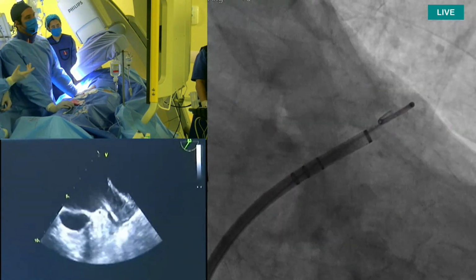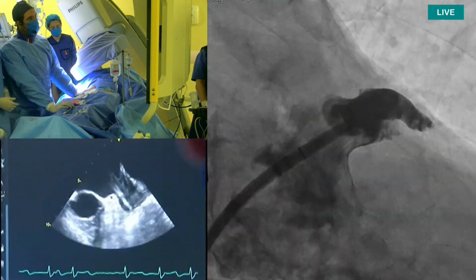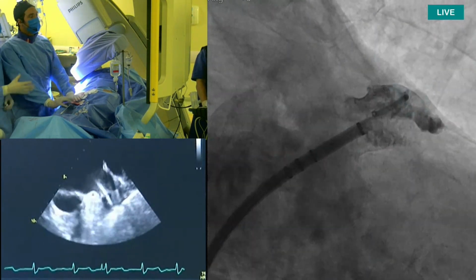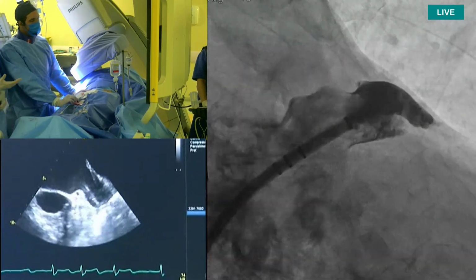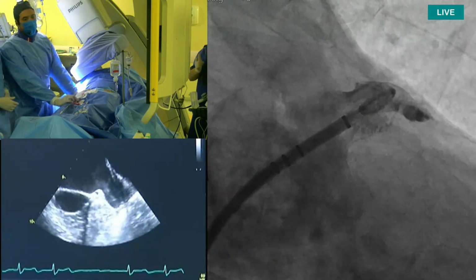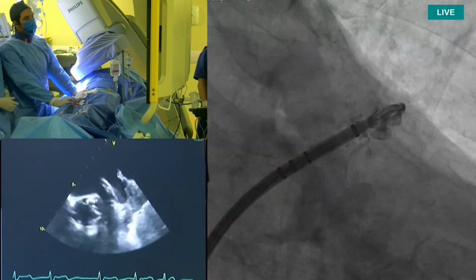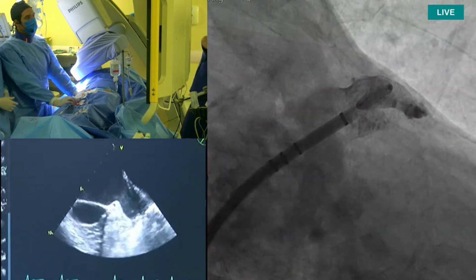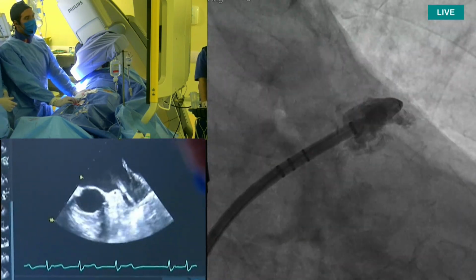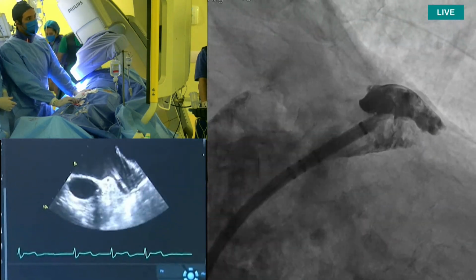Then maybe Fábio or Felipe, you can comment on the markers there for the delivery sheet. Do you look at this, or do you not look at this? What's your habit? Do you do sizing on angio or not really? Felipe: Nowadays, not anymore. I don't like to do the sizing on the angio. We used the markers for the first generation, the 2.5. Nowadays, I usually don't use them too much. I really trust the echo from the image inside we have, and we still have all the pre-planning from the CT scan.